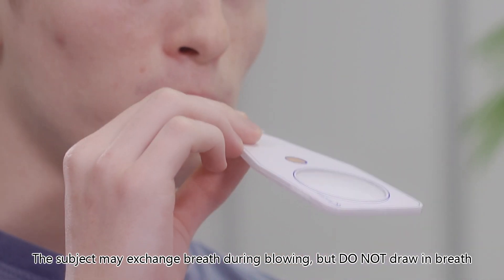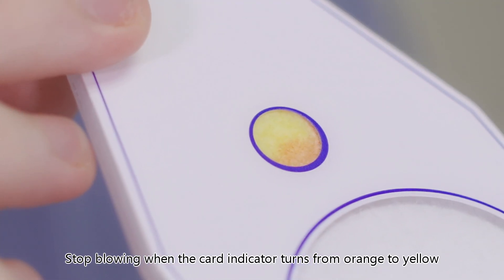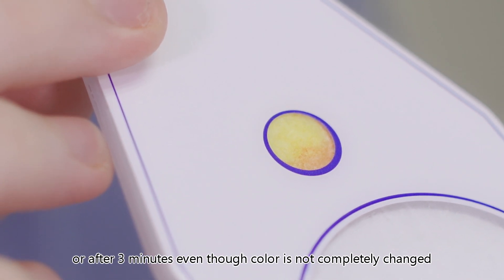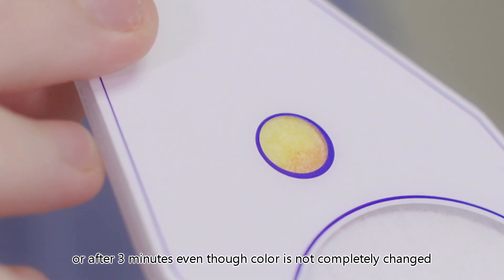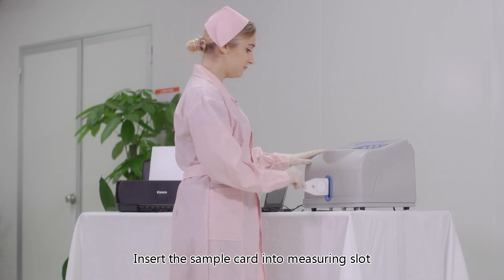The subject may exchange breath during blowing but should not draw in breath. Stop blowing when the card indicator turns from orange to yellow, or after three minutes even if the color has not completely changed.